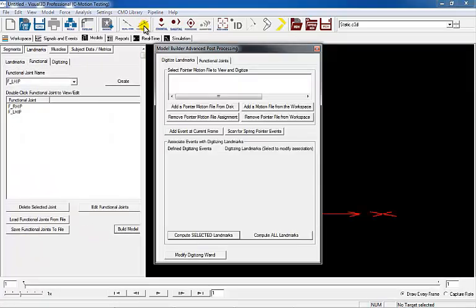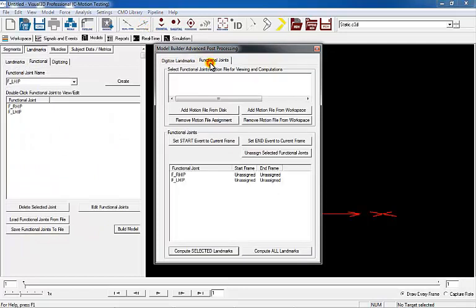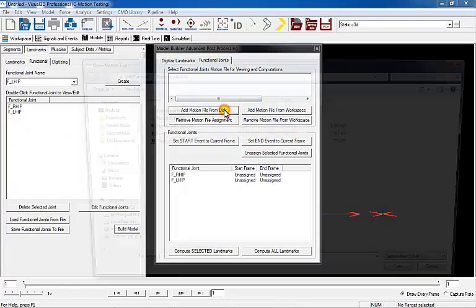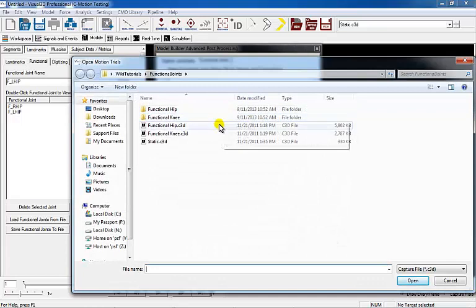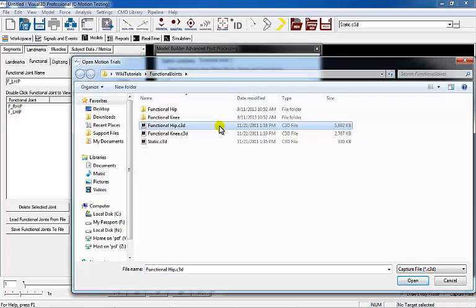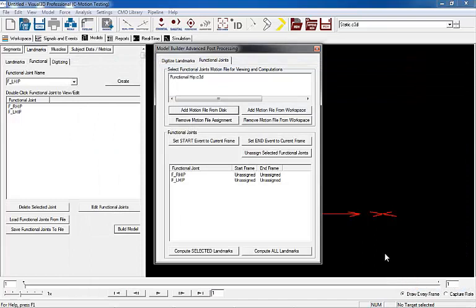Select the Post Processing button from the menu and the Model Builder Advanced Post Processing pop-up dialog will appear. Select the Functional Joints tab and press Add Motion File from Disk. Select the Functional Hip Motion file.